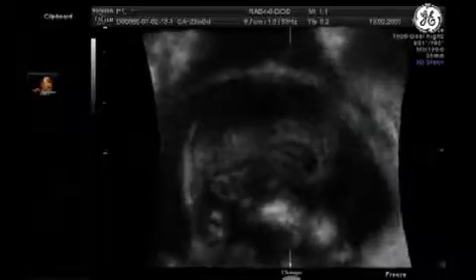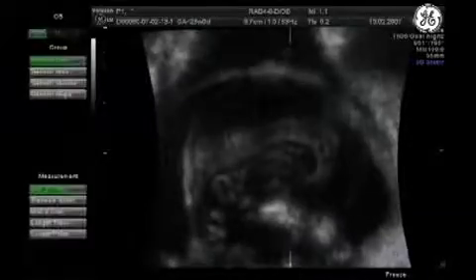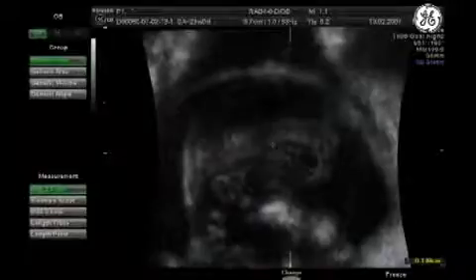I turn. And when you turn, you can see the shape of the corpus callosum here, and you can do the measurement. So this is the first way to obtain it, is to take a block and to move inside the block.